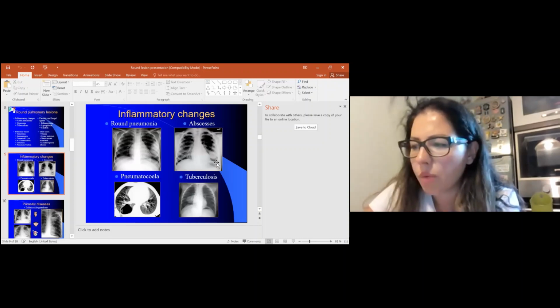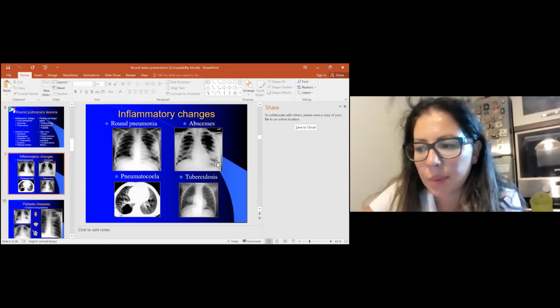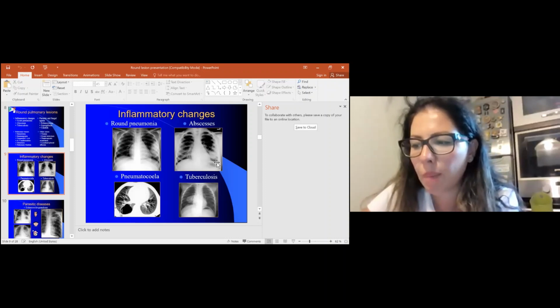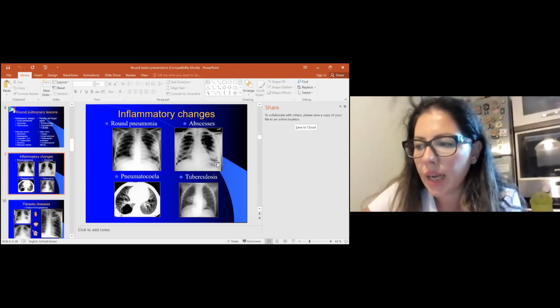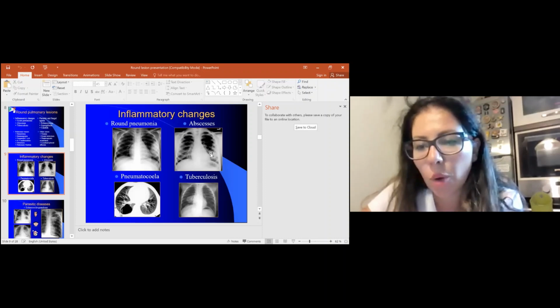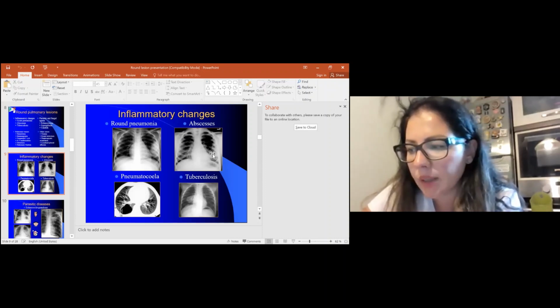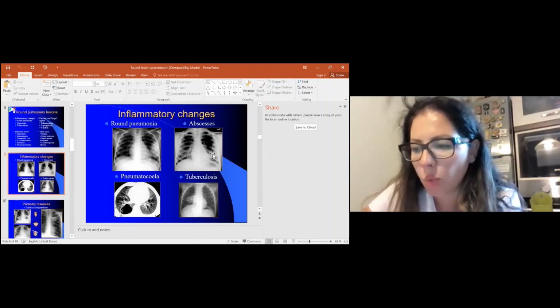Abscess. Radiographic image of abscess begins with pneumonic infiltration as a first step. After penetration of necrotic mass in the bronchus, cavitation becomes visible, and we can see a hydroaeric level. After complete expectoration of necrotic masses, a residual cavity with thin walls remains.